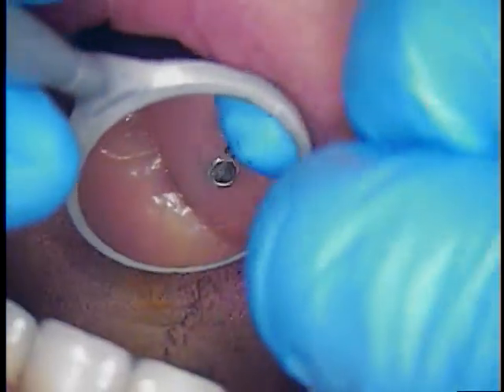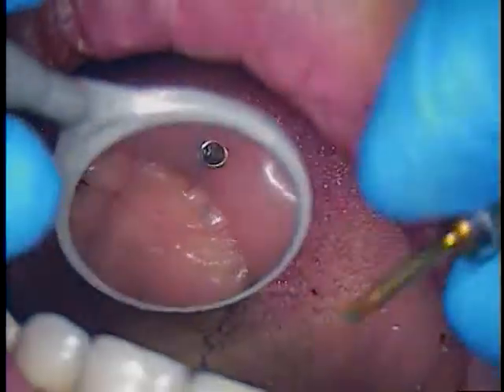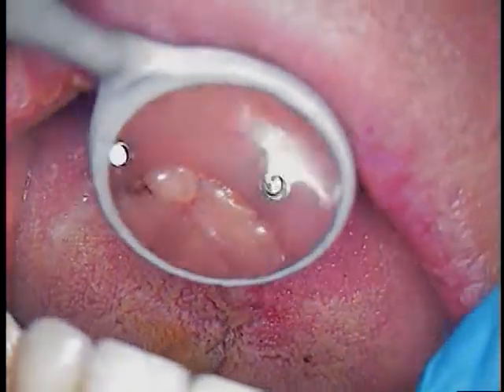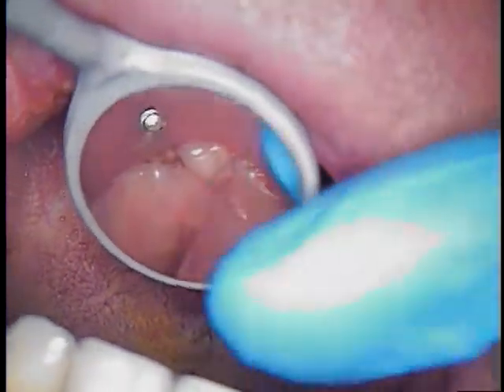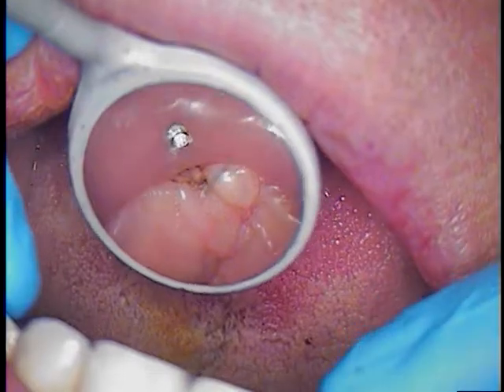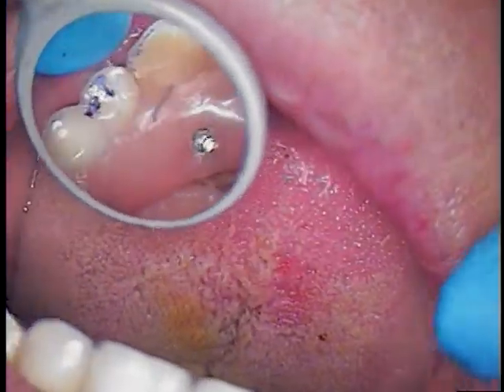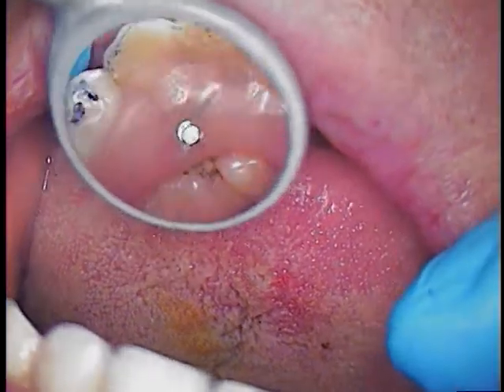With hand tightening, you can actually feel the metal-to-metal interface and how well that is on each one of the screws — there's no further tightening. Your fingers would feel that movement. But because they all bottom out at the same level, there's no rocking; it's a passive intimate fit. Really, the screws don't have to work as hard. And now that the bite is better, we'll move forward.